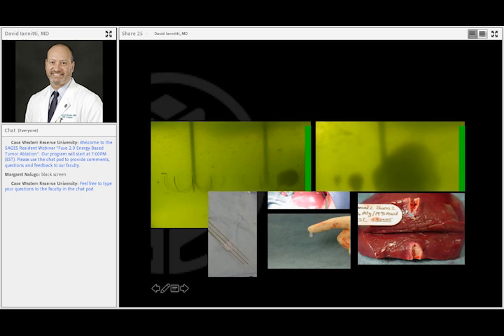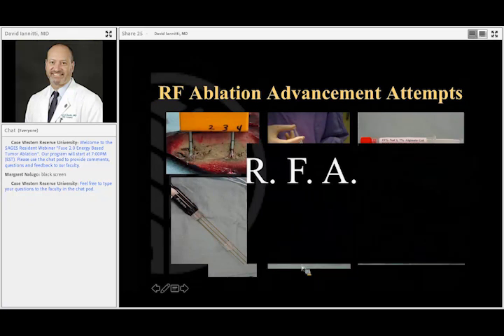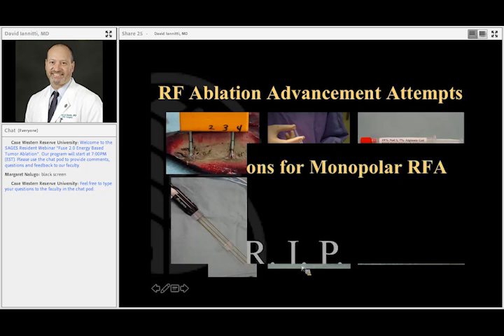We've done a lot of work trying to make RF better with multi-probe ablation for deployable arrays with cooled tips, with newer controllers, using hypertonic saline and alginate gels. Basically, our conclusion with monopolar radiofrequency is that we've sort of moved on from them. Clinically, I've been doing microwave ablation since 2003, and it's been commercially available since 2008.